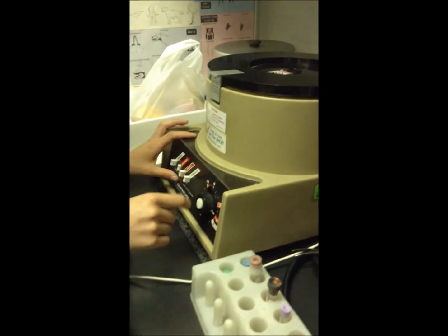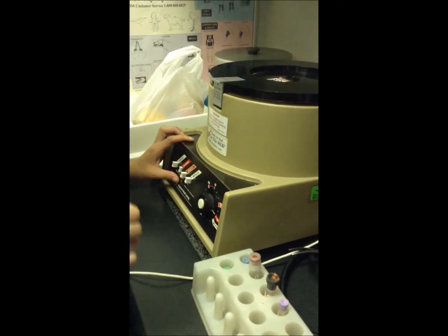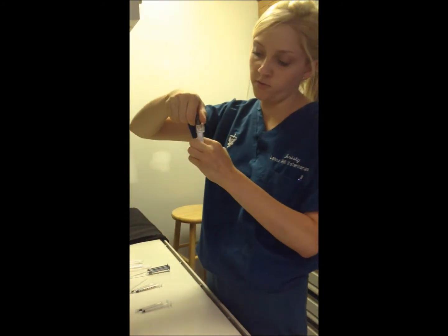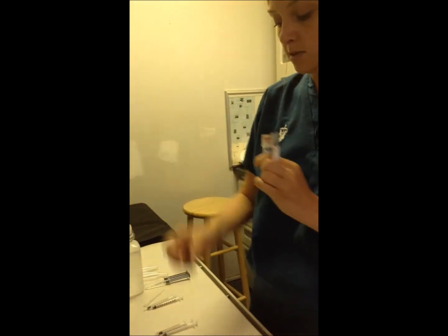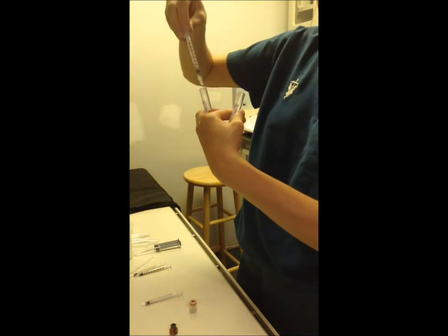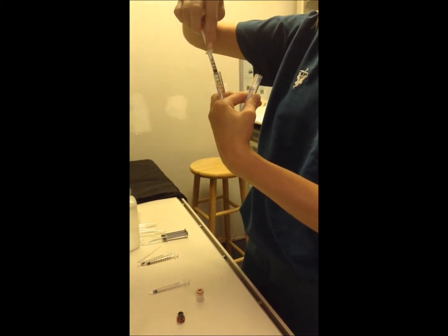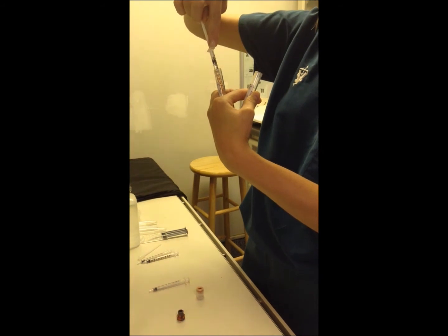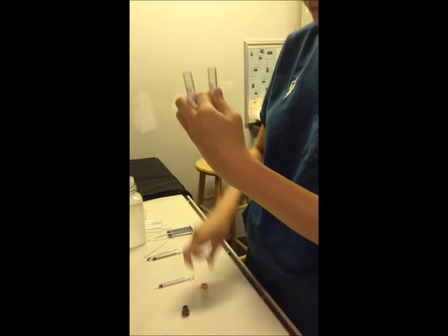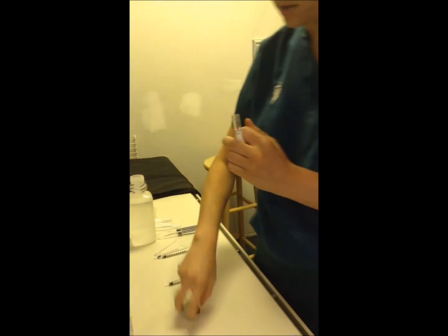And then we're going to put it on blood and start it and spin it for 5 minutes as well. Good. Remove the serum. This is the donor tube for Ruby, and we're going to stick the serum in a red top tube. So we'll just take all the serum out. Going to place that all into the regular red top. Okay, and we'll put that to the side.